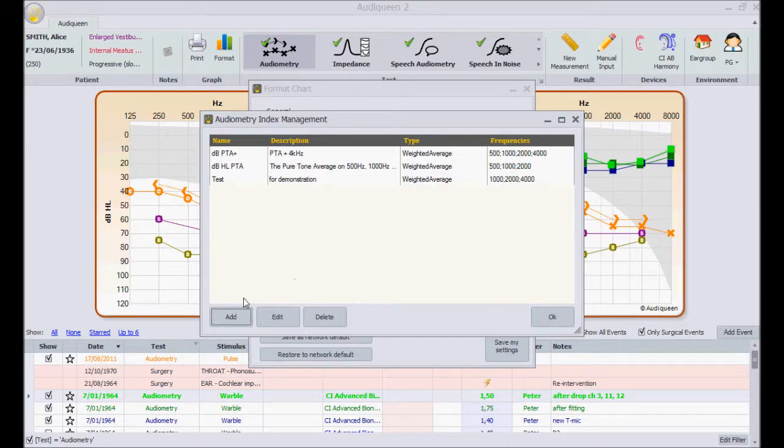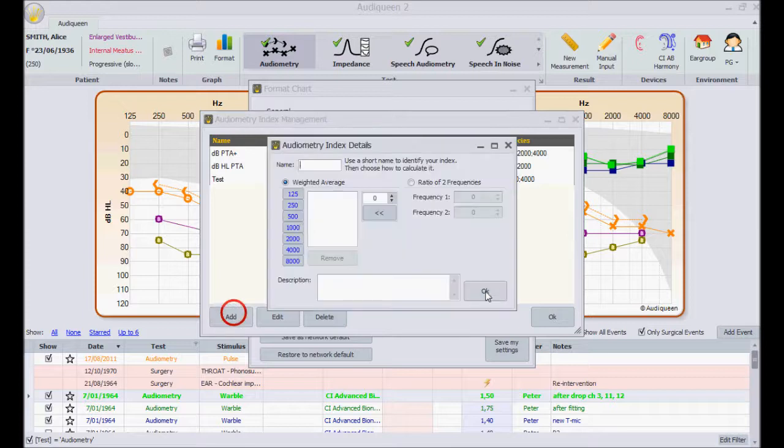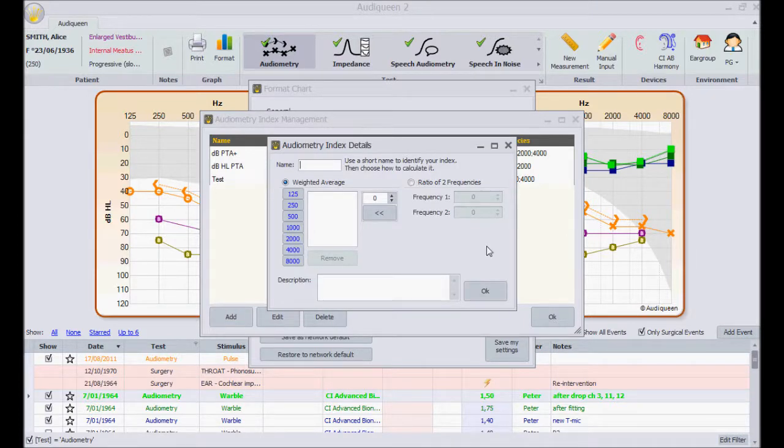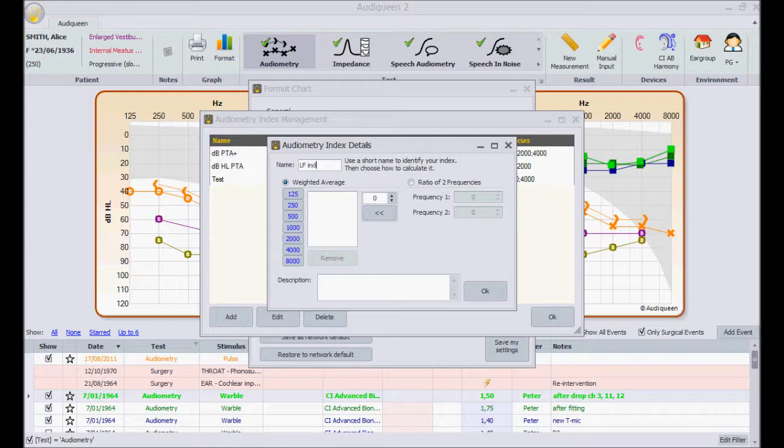Or yet another one. Suppose I'm conducting a study, and I need an index showing the ratio between the thresholds at 250 and 2000 Hz.